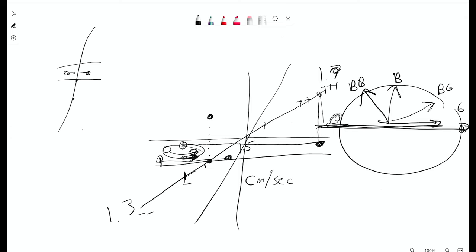So at that point, I would recommend doing a gradient echo sequence with a really short TR and a really short TE. So at GE, you could do like the LAVA sequence, Siemens, the VIBE sequence, and the vessels. I would wait a little bit for the contrast to get mixed to where you reach closer to an equilibrium. So the contrast is not just arterial, not just venous, it's kind of spread out.